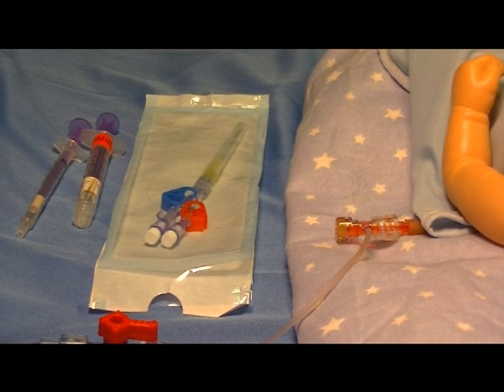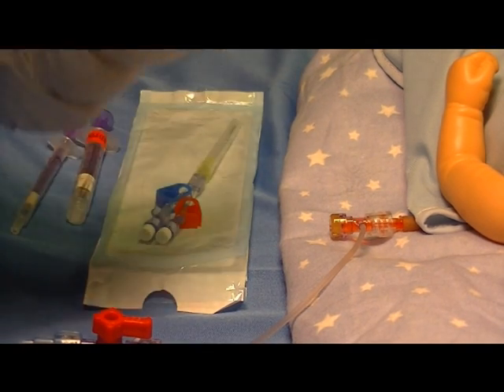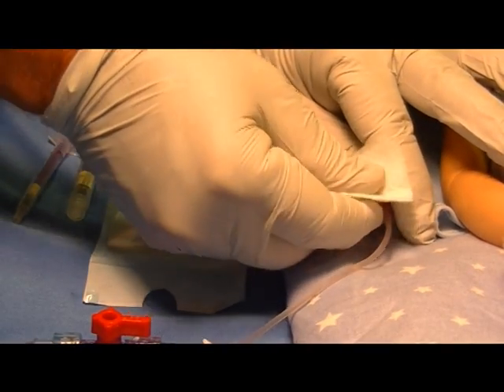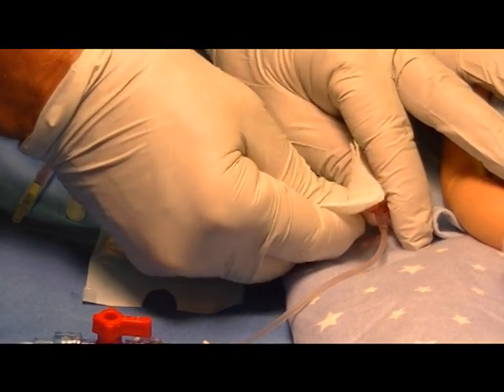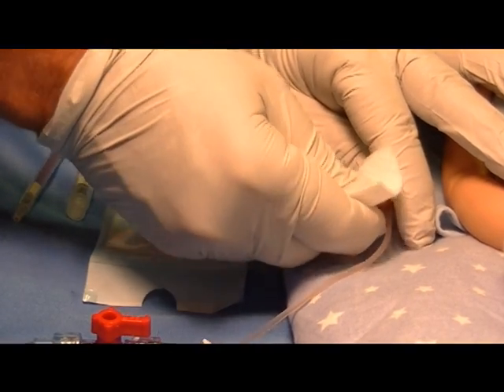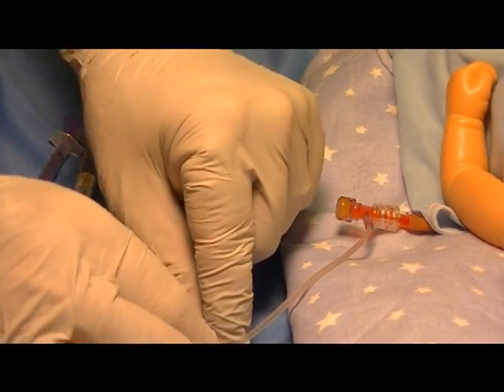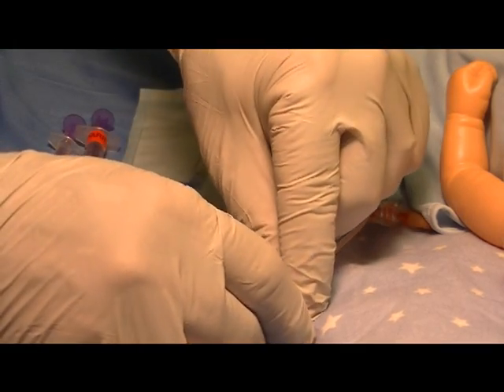The first step would be to prep the T-connector according to your hospital's policy and then to clamp the T-connector to prevent flow from the line.